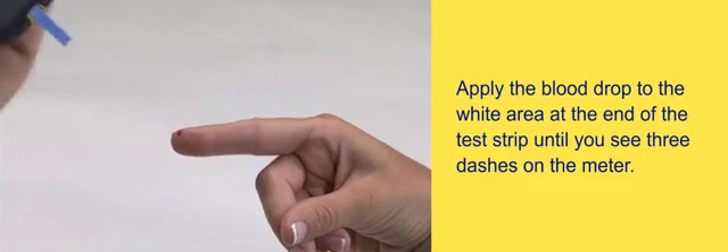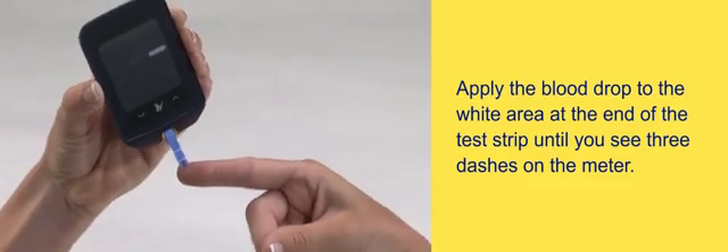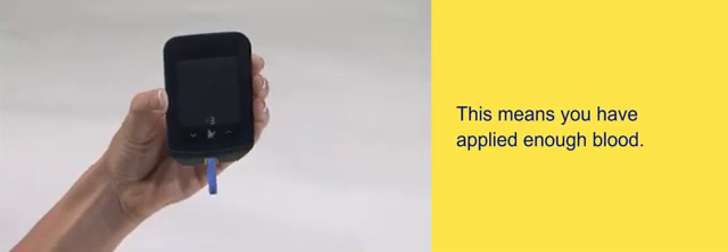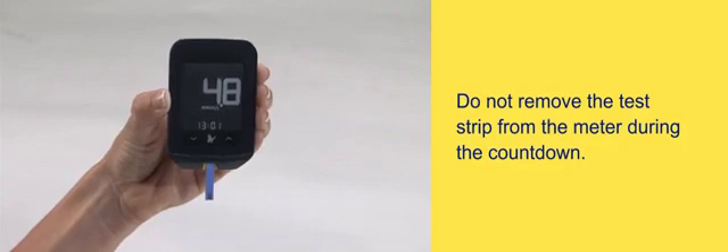Apply the blood drop to the white area at the end of the test strip until you see three dashes on the meter. This means you have applied enough blood. You will then see a five-second countdown. Do not remove the test strip from the meter during the countdown.